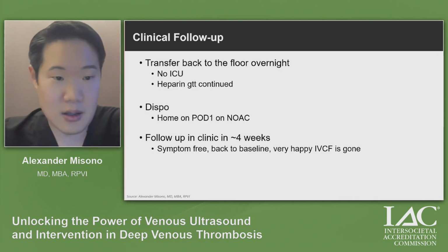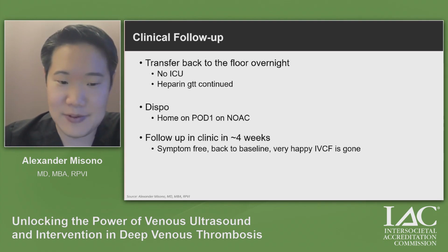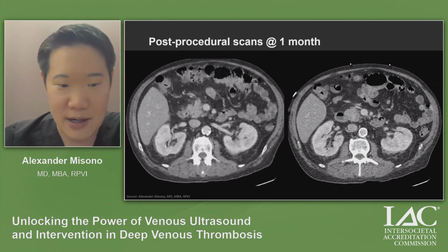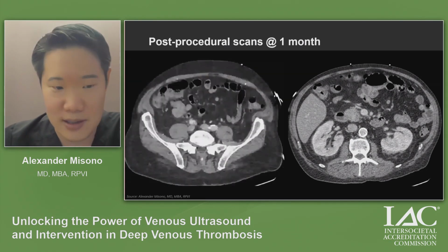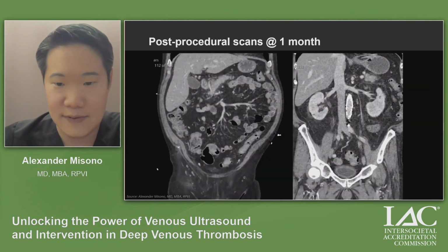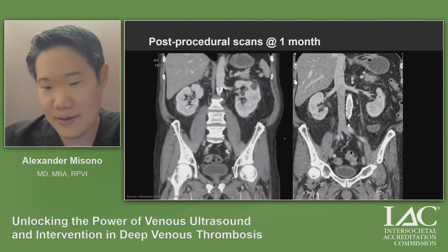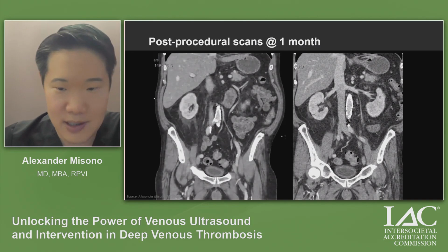So this patient did very well. They went to the floor. They didn't go to the ICU, even though they had a big DVT. They went home post-op day 1 and returned with no symptoms. And we did get a post-operative CT scan to ensure that everything looks good as it does on the angiogram, and indeed it does. So there is no DVT left over on either the axial or the coronal reformats. And obviously the IVC filter is gone as well. It looks like there's good contrast flow throughout.